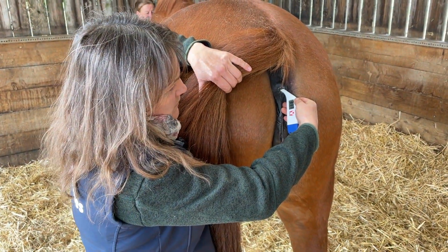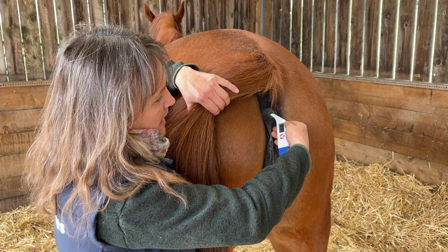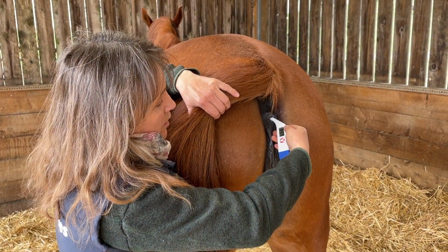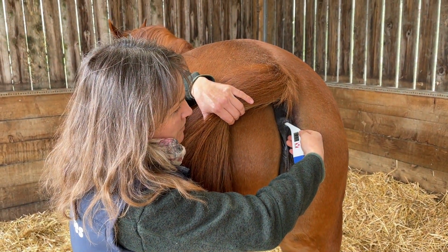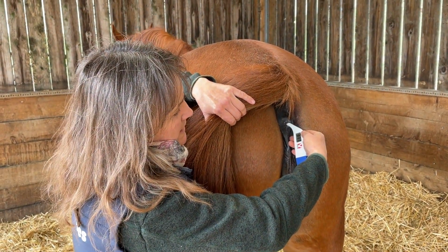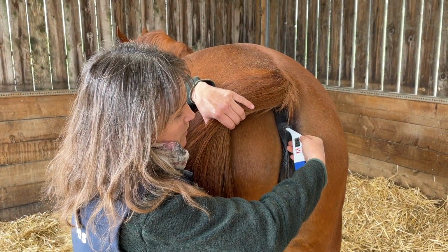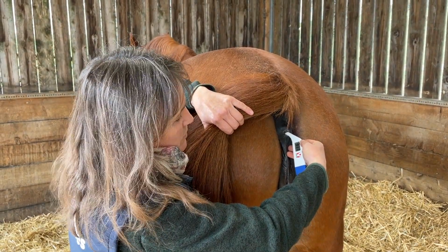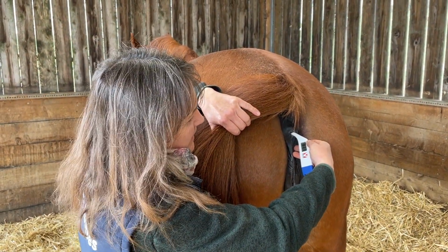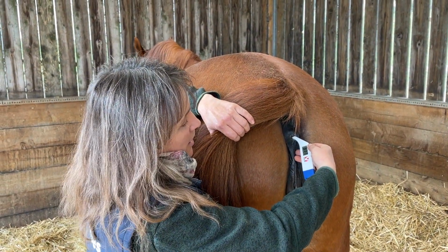And you can see that it's very quickly picked it up, and we've got to wait because I can't remember, I'm pretty sure this one bleeps. Some bleep, some flash, some don't do anything, but usually it takes about 30 seconds for you to get a correct reading, and you've got to wait it out. So we'll wait it out and see. Sometimes you wonder whether you've given up or the batteries have gone or whatever. I have a feeling this one might not bleep. Should have thought of that before we started.